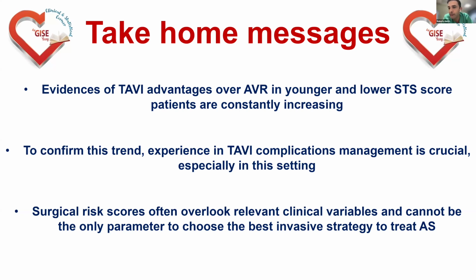Yeah, we use the radial one, okay. But in many centers, I know, for example, our colleagues from Catania, they still use the femoral, but it's something that can obviously be decided according to your practice. And do you choose this strategy in every patient, or selecting the most complex vascular access?